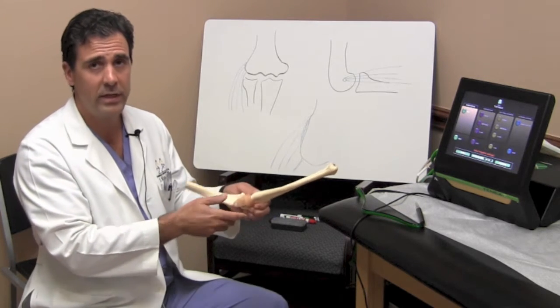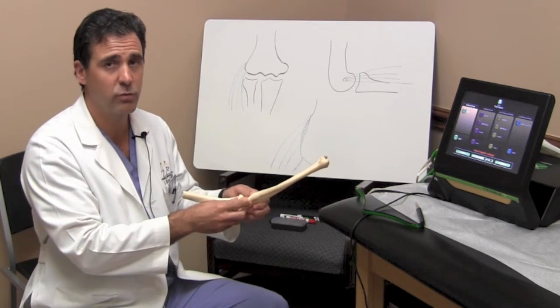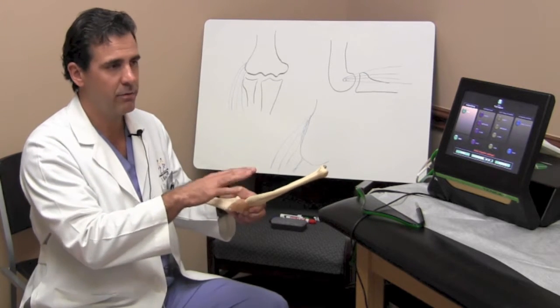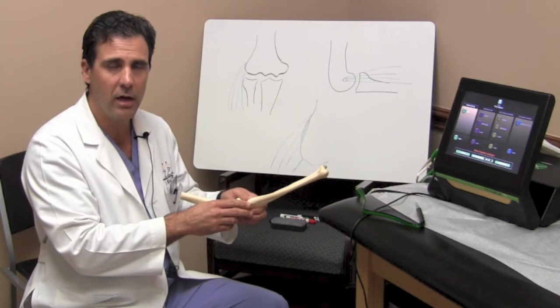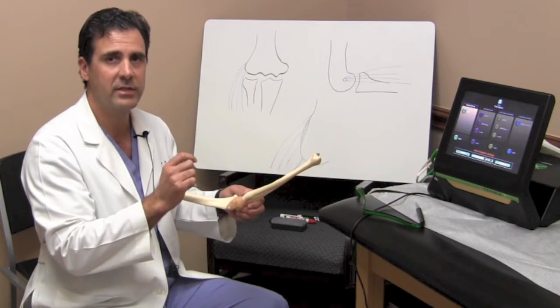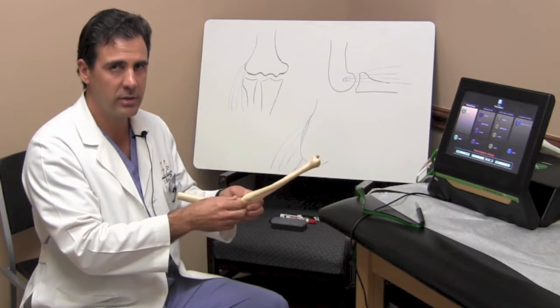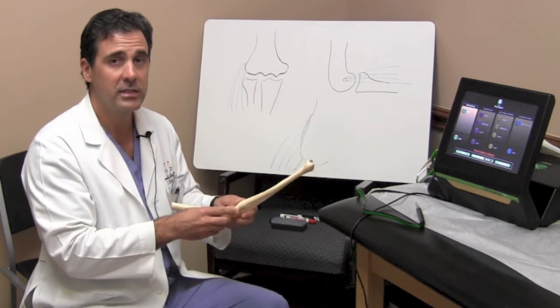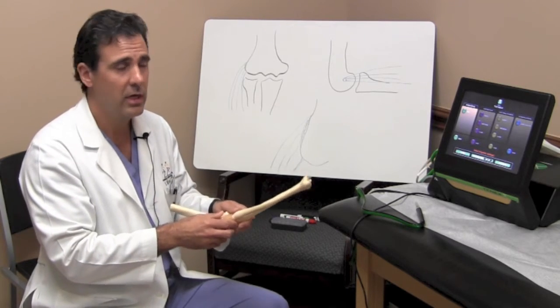If it gets to that point, it becomes a more complicated solution, and this type of option may not be a good option for that patient. However, for those specific patients who have tendinosis or degeneration within the common extensor tendon, this procedure, called Tenex, is a very good procedure.